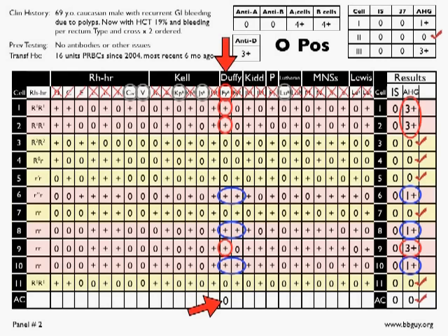If you look over on the left side of the panel, you see we only have one homozygous or double dose rule out for big C, anti-big C and anti-big E. So you have some additional work there to make sure that those are not the target of your antibodies. But fundamentally, this is an anti-Duffy A.